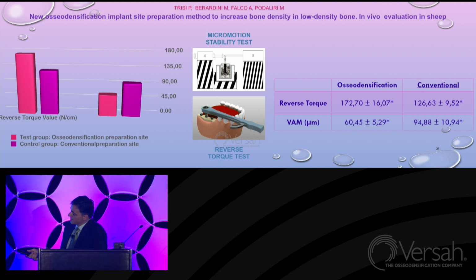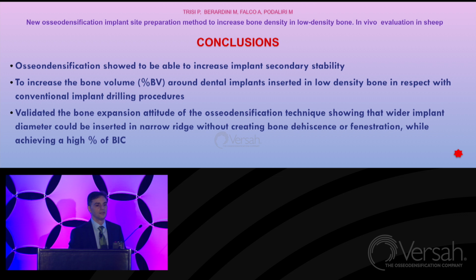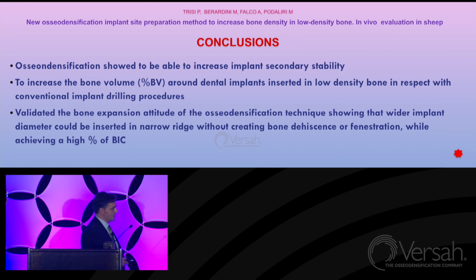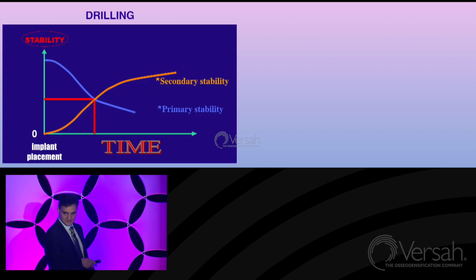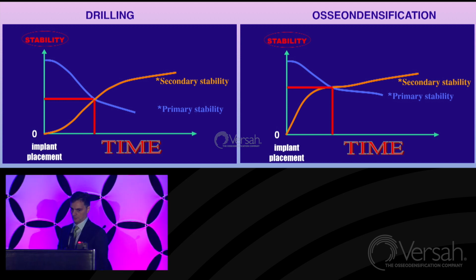The conclusion, of course, is that osseodensification is able to increase the secondary stability and to increase the bone volume around the implant in low-density bone with respect to the conventional drilling procedure. It validated the expansion aptitude of the osseodensification technique, showing that wider implants can be inserted in a narrow ridge without creating dehiscence or fenestration, achieving a high bone-to-implant contact and a good secondary stability. So now the famous curve of primary and secondary stability changes. I think we are now facing a new era where this curve, Paul, like you said, is changing. And this is because we are changing the protocols.